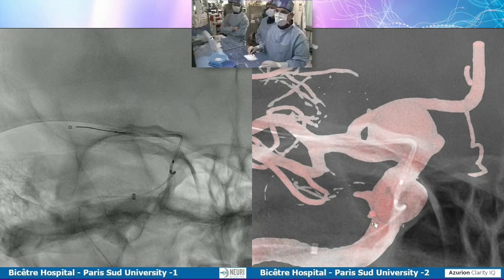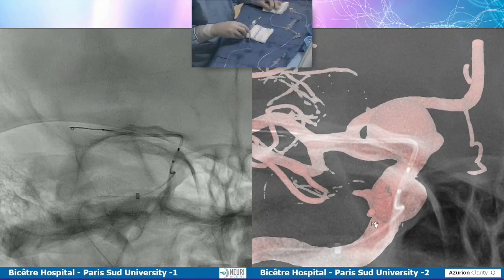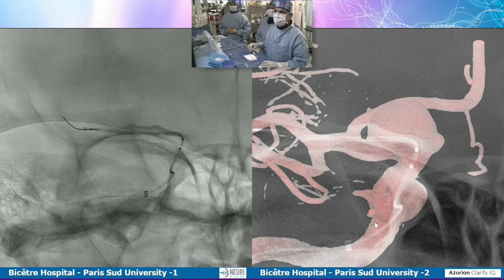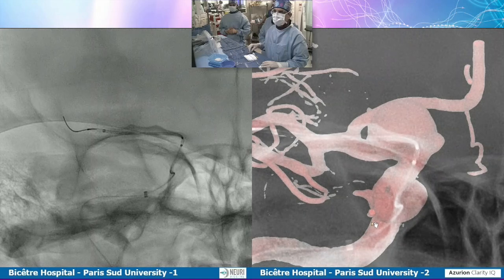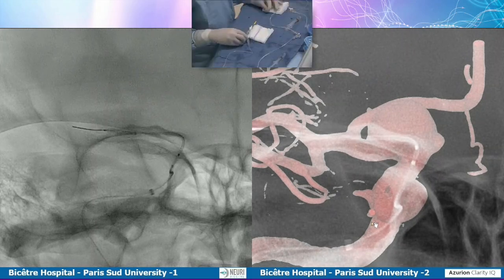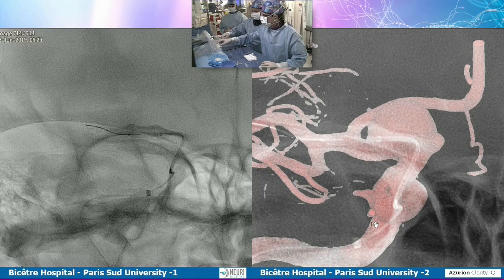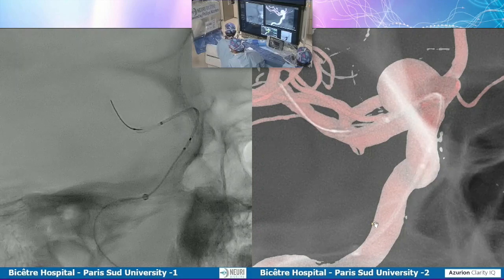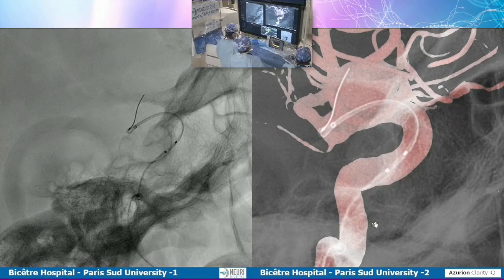It's a straightforward anatomy. See that, with the 3D roadmap, you see how, because you obtained it before you put the catheter and guide wires, it seems to be a mismatch. So Jacques extruded a little bit and then brought it back. Okay, he's trying to fix the best view to understand where he's going to land.